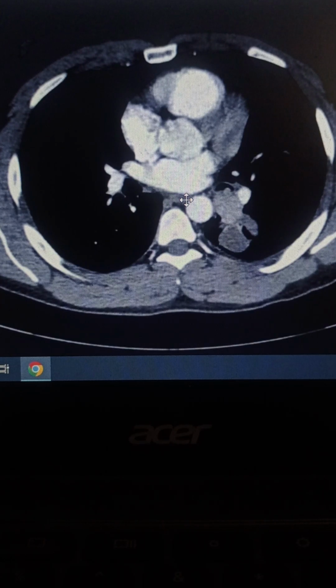One hallmark I am going to give you that will give you surety that this patient has a bronchial carcinoid tumor is an enhanced, hypervascular lesion seen on the CT. That will give you an idea that this patient has a bronchial carcinoid tumor.